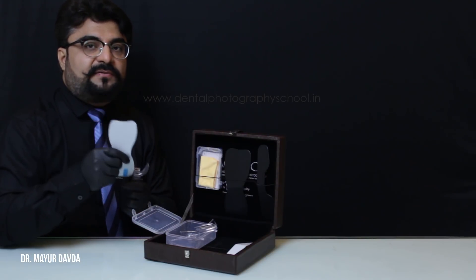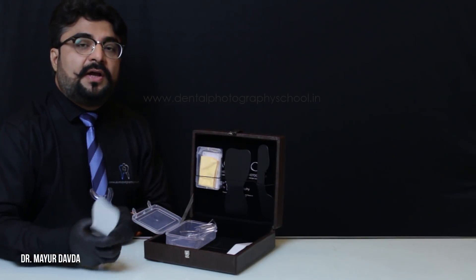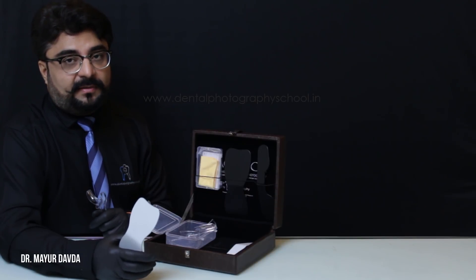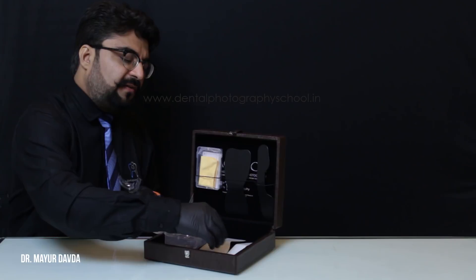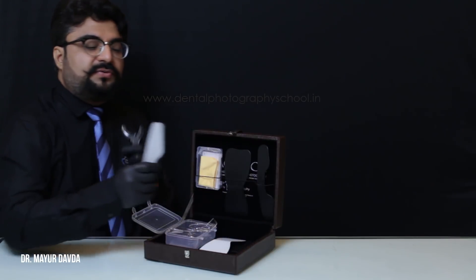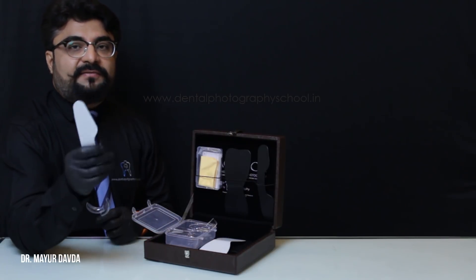For pediatric patients, or patients with limited mouth opening, you can use the smaller side. But for most of my documentation in my clinic, I use the quadrant mirrors 95% of the time.